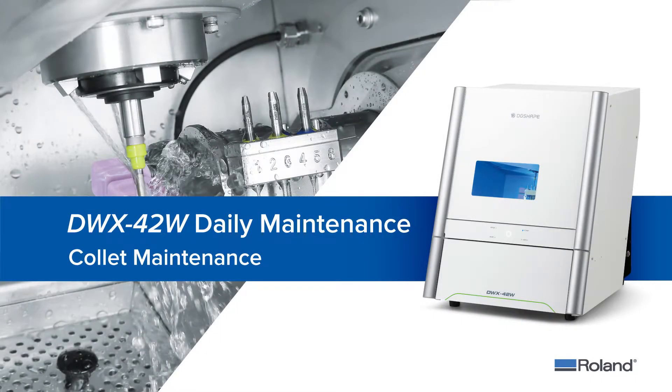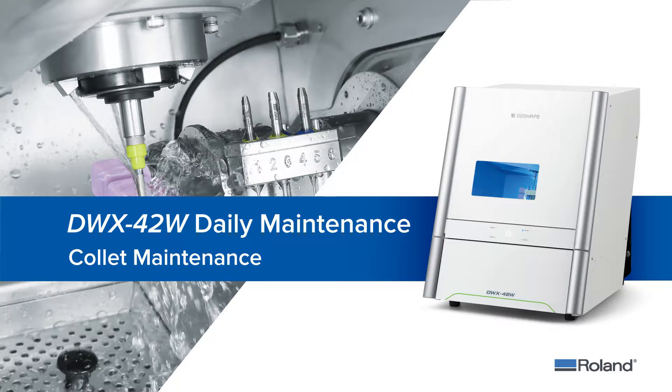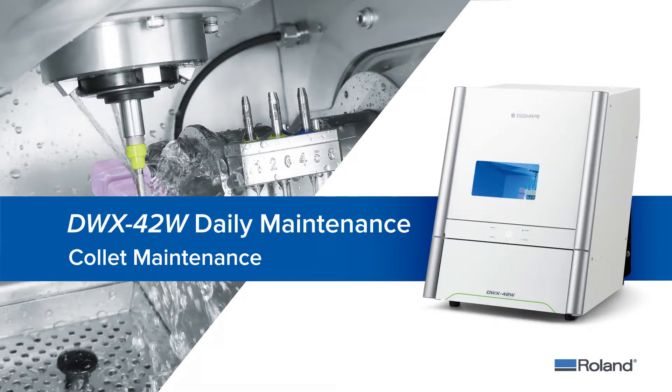This video will walk you through the steps to complete collet maintenance for your DWX-42W wet dental mill. This operation must be performed daily to ensure successful operation of your device. This procedure helps keep the collet clean of material waste, extending the life of your mill.